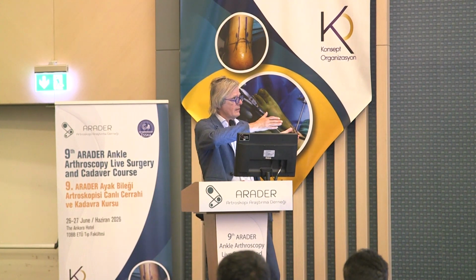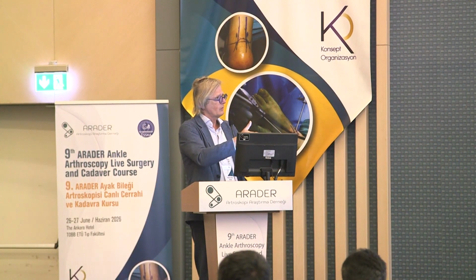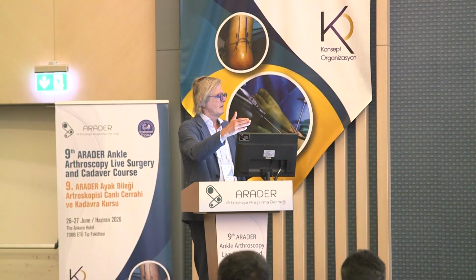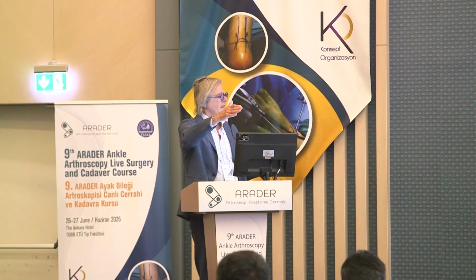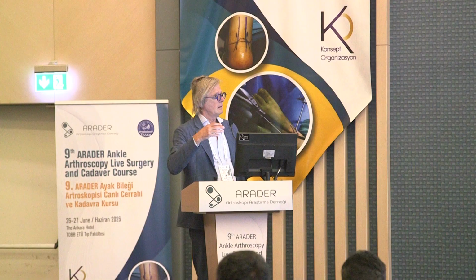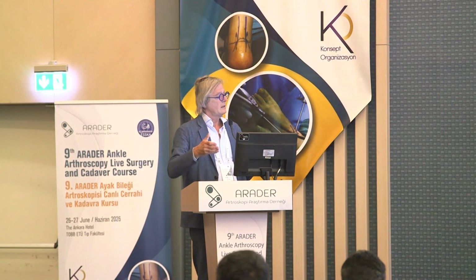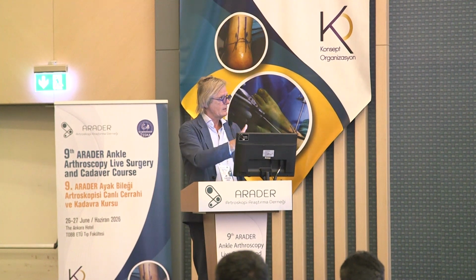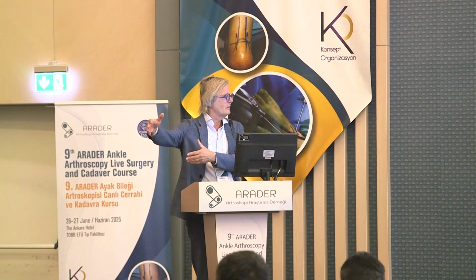So if you dorsiflex, the chance that you get a new impingement of the soft tissue is quite high. So you better remove the osteophyte, you have more space, and then the patient will not develop a new impingement in the early phase. The soft tissue will shrink, will go less and less, and the osteophyte comes up, but that takes quite some time.